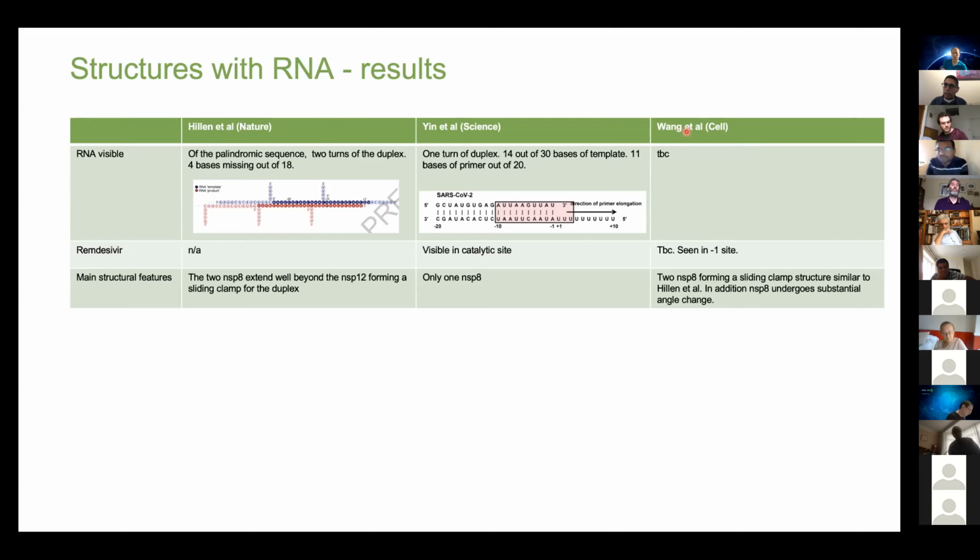Wang et al., I think, has done a lot more. I'm still in the process of looking through this, but I think what they see is different from the Yin et al., because I think they see it being incorporated one in, so it's seen in the -1 site.